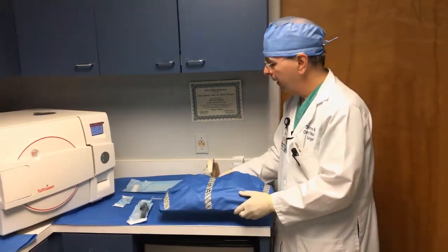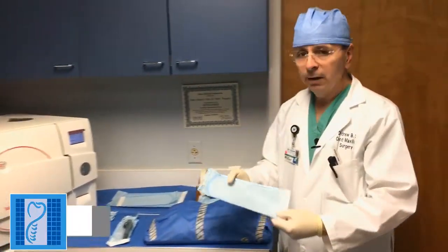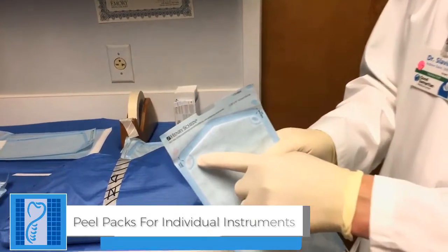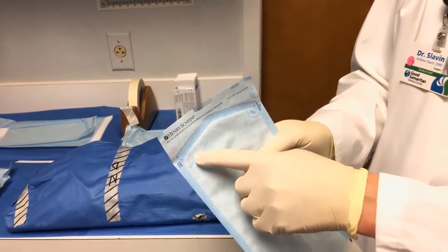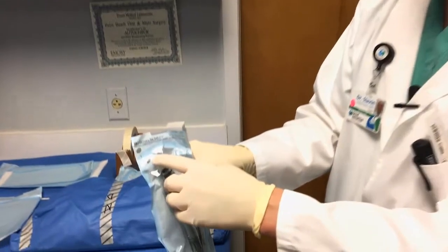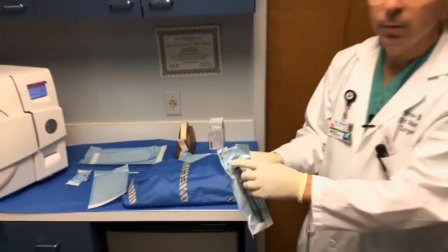In addition to that, we have these peel packs, which smaller items are put into. There's an indicator which is pink that indicates the item is not yet sterile, and then once it's put into the sterilizer, it comes out as dark gray, and that indicates that it has achieved sterility.